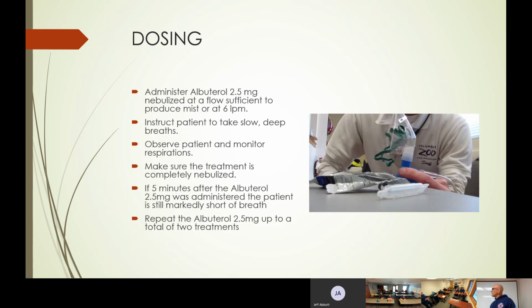Is that a Venturi thing or something, Anthony said, right? Yeah. Okay. So that's a little bit different now too. So be sure you're familiar with that, but it's on the inhalation. There's a Venturi fan that basically vaporizes instead of that constant flow. So we can just make sure you're familiar with what we have.